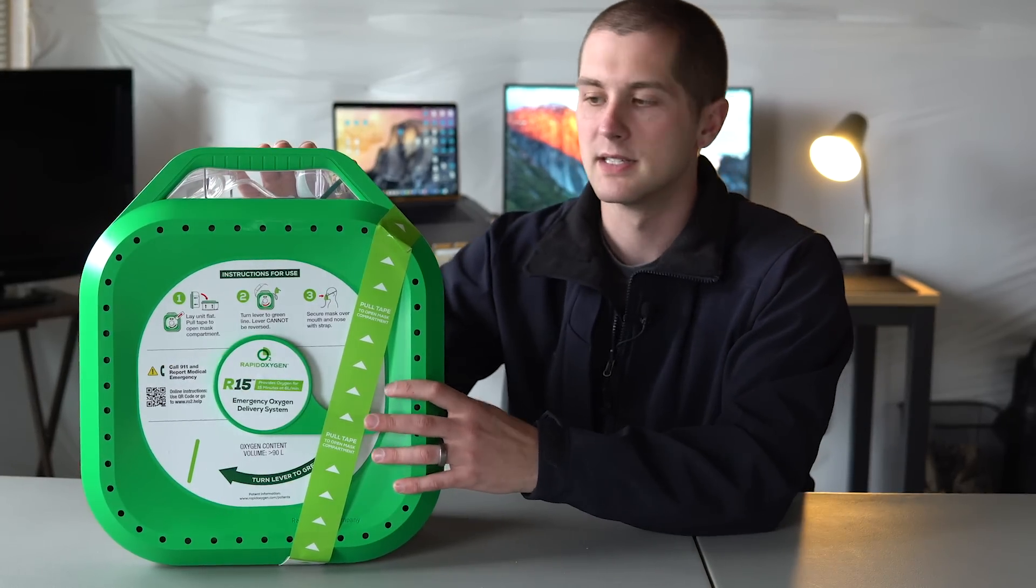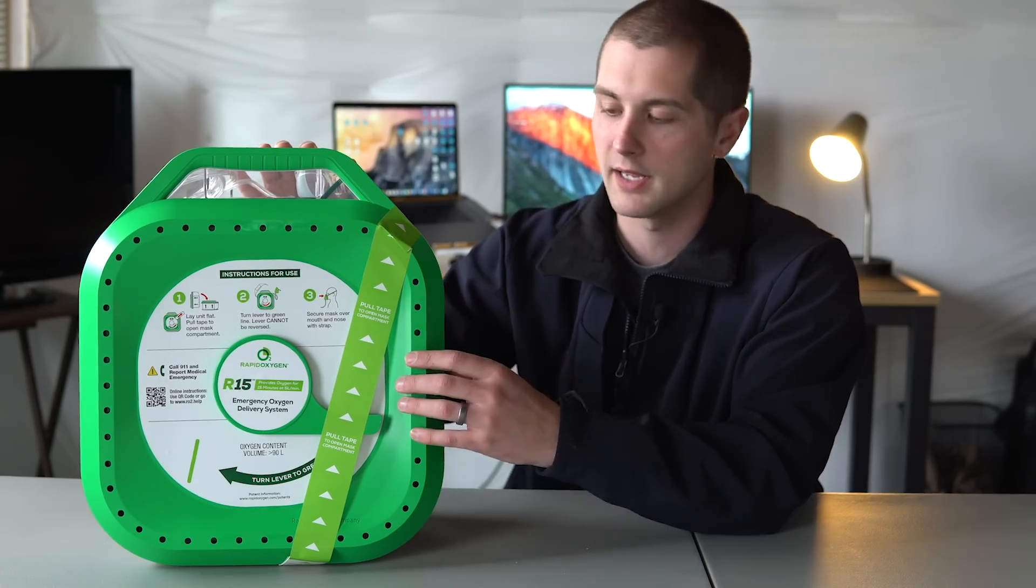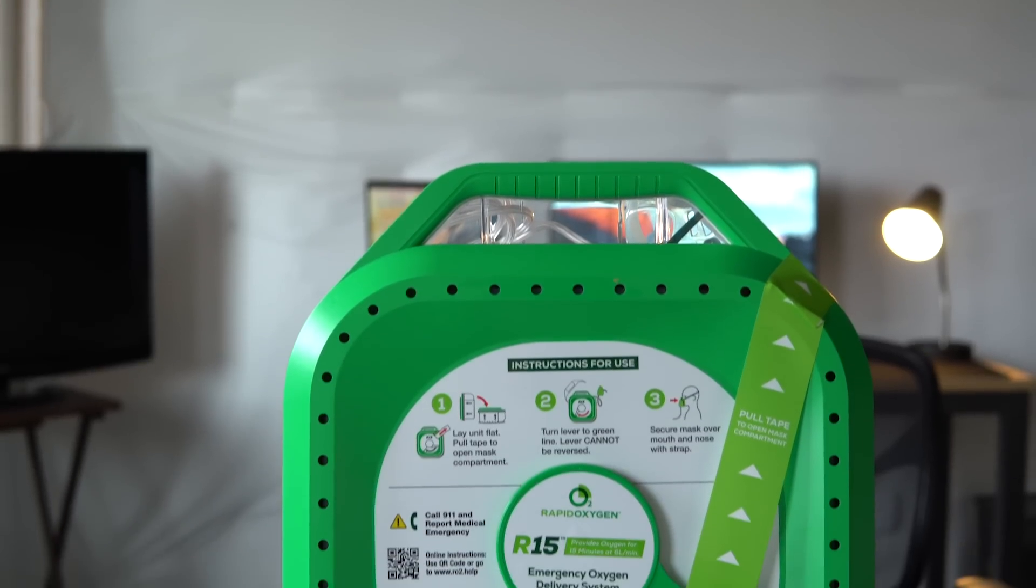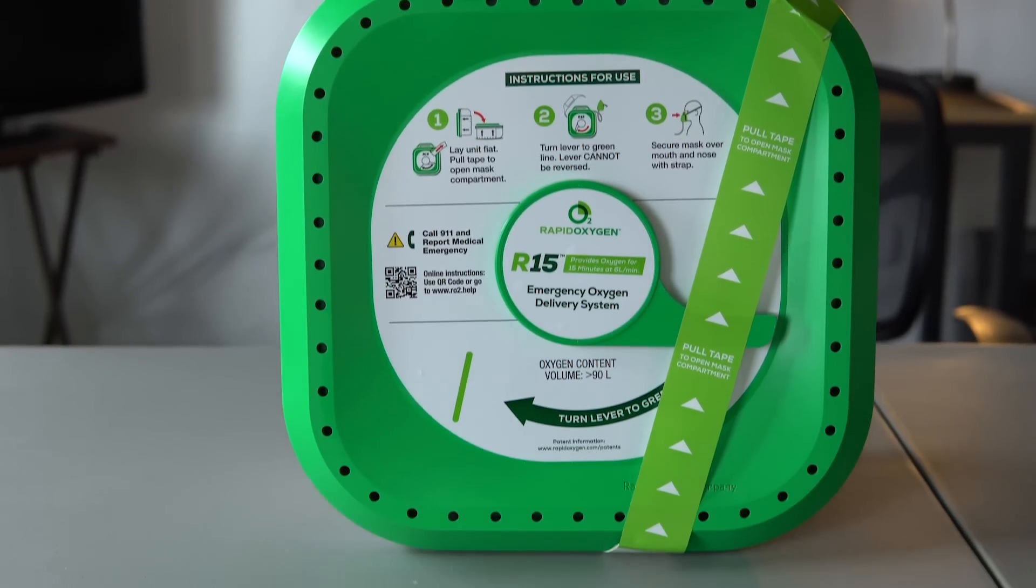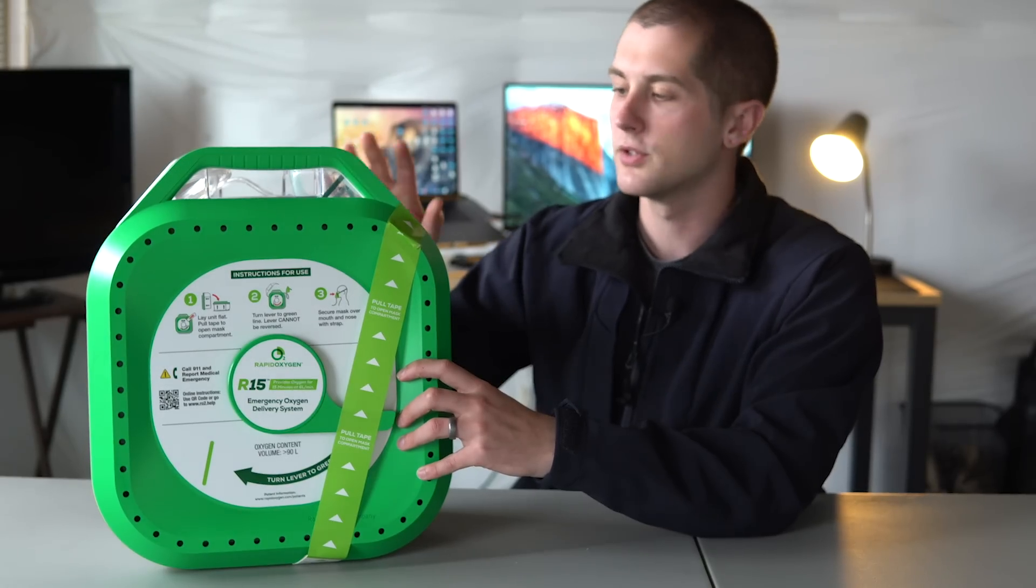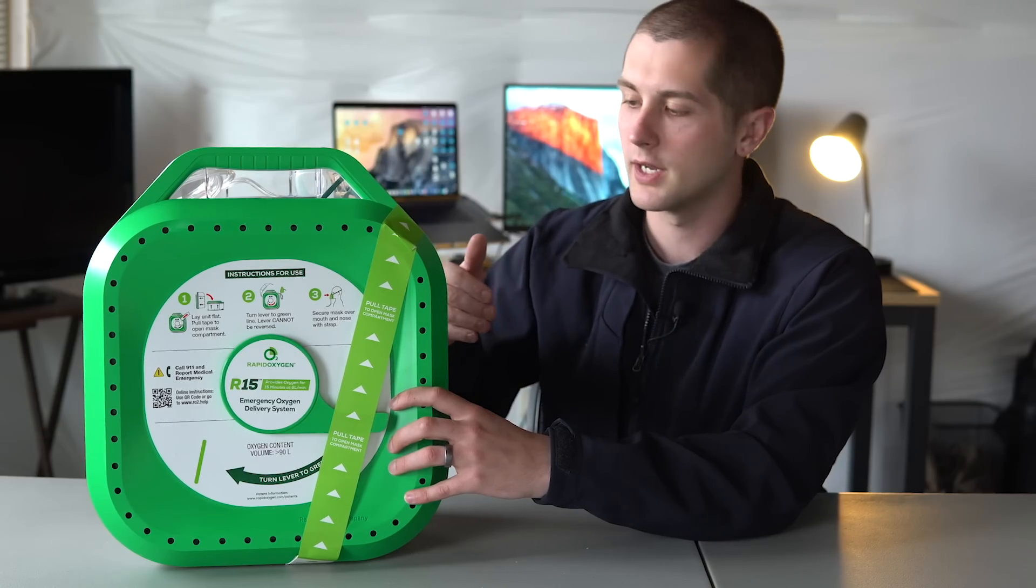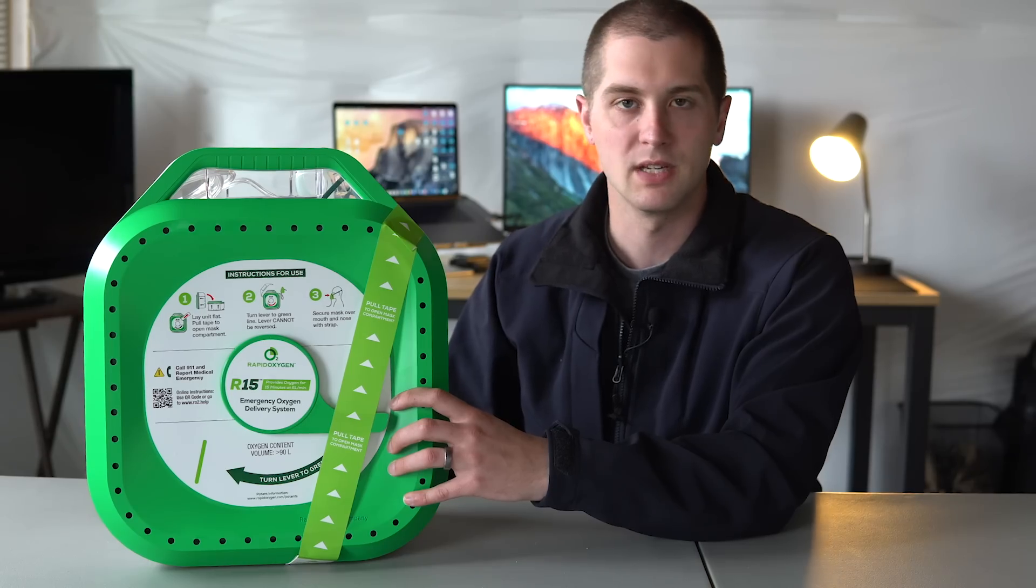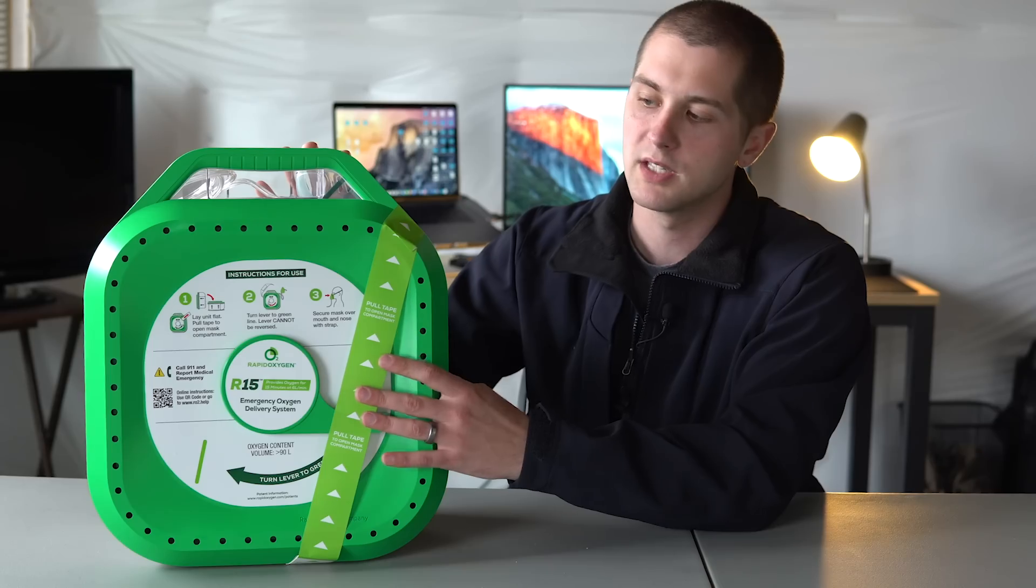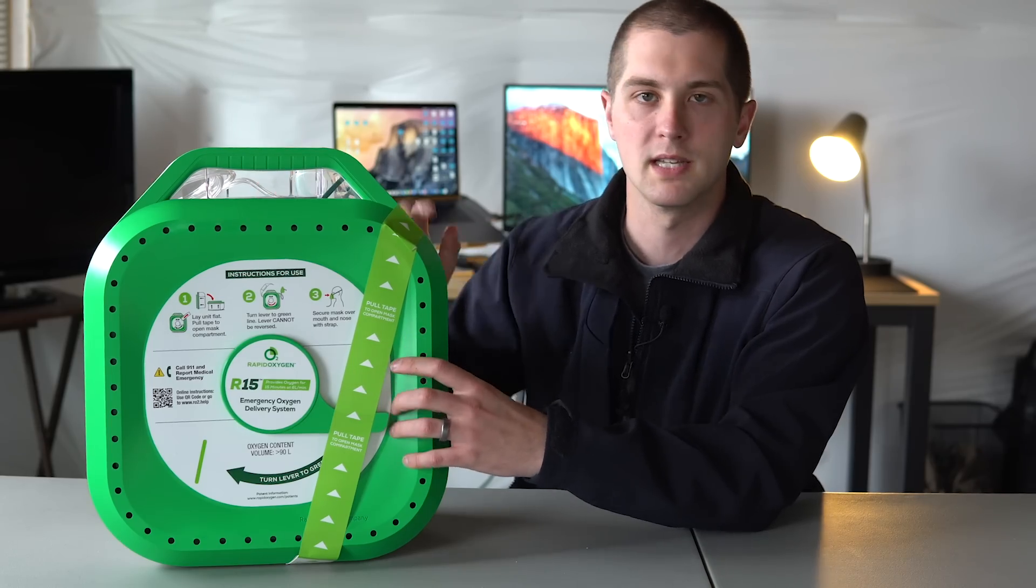Essentially what this device is, is this is made by Rapid Oxygen, like I said before, and they're a company based out of Connecticut in the United States. And this is the R15. So the R15 is designed to allow civilians with no training to bring this out and pull one lever, which I'll show you guys in a second, and provide the patient with six liters per minute of oxygen for 15 minutes. If you don't know, oxygen is measured in liters per minute for its dosage. This is technically a medication, but because this is basically an automated system, this falls under the same laws that an AED does.